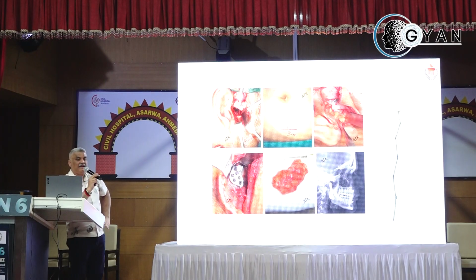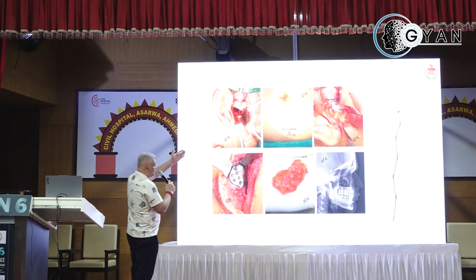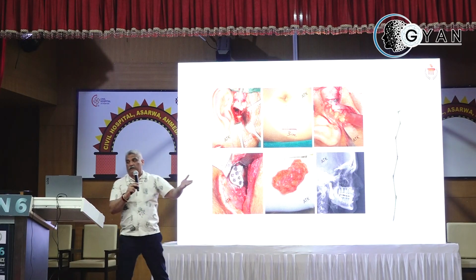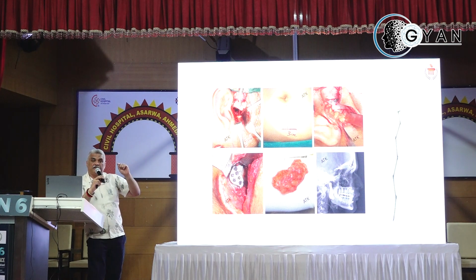Role of TJRs in trauma. A patient with condylar fracture managed conservatively, went into TJR, went into ankylosis. And this is how I do my fat, what I picked up from George Dimitrovich, where Sonal spoke about periumbilical fat harvesting. For me, what works as the simplest maneuver is to place an incision say possibly 3 centimeters from the umbilicus coming down to the subcutaneous, harvesting fat there. Now the question is, when you're doing your TJR, how much fat are you harvesting after the joint replacement and why?